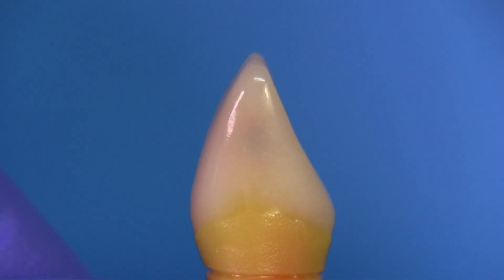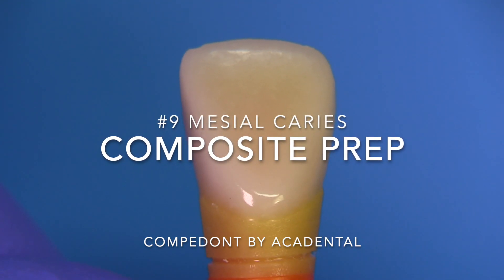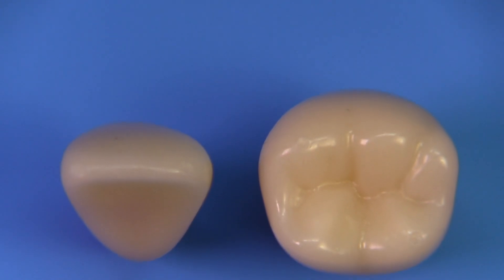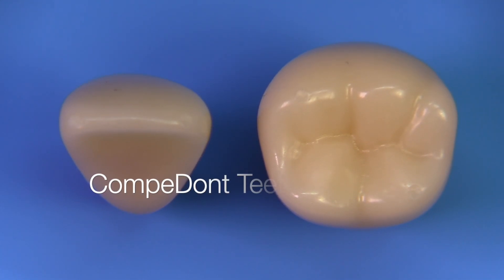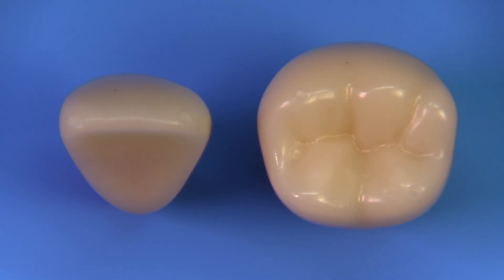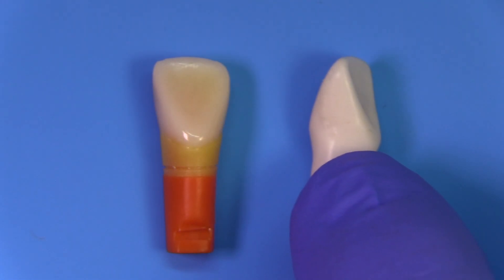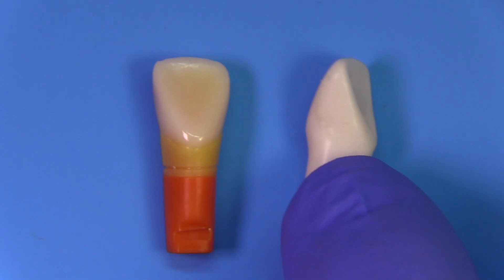Today we're going to be covering the composite preparation on tooth number nine on the Confidant tooth as developed by Academil. Currently they have two of these teeth available — one is a molar and one is the incisor — and today we're going to be working on tooth number nine. In a subsequent video I'm going to make another video on tooth number 30, distal caries.